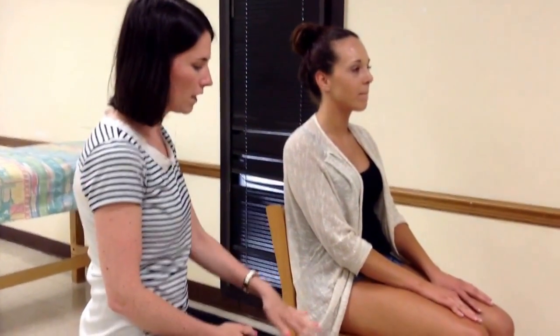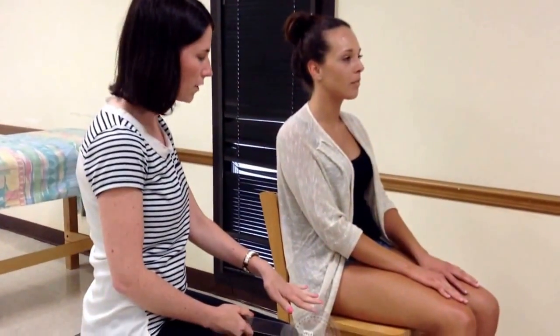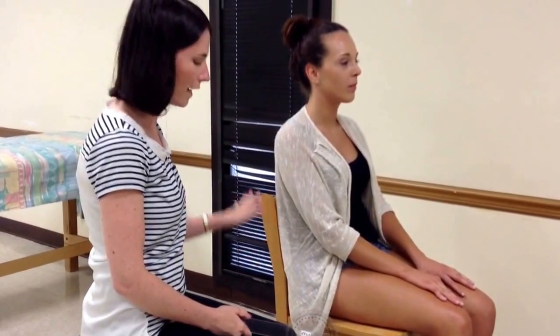We're going to do goniometric measurements for cervical flexion and extension, both of which occur in the sagittal plane and have a firm end feel. The patient is sitting in a chair, feet are flat on the ground and supported, and her back is supported by the back of the chair.